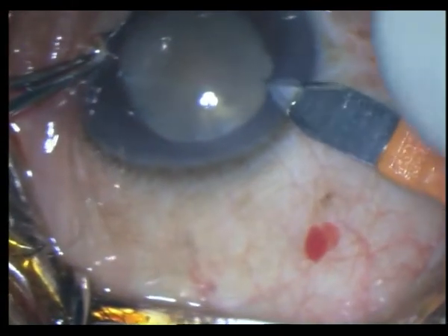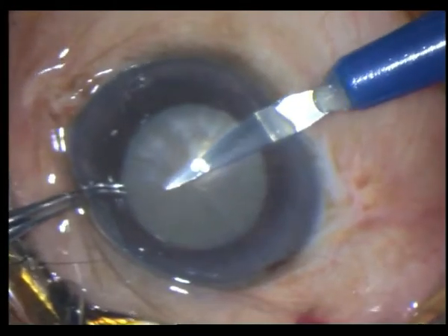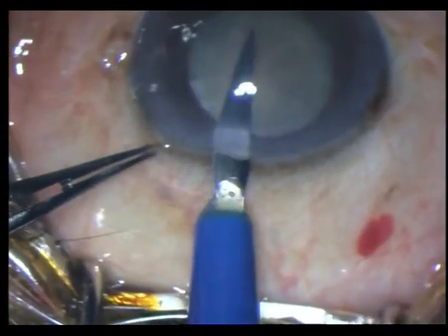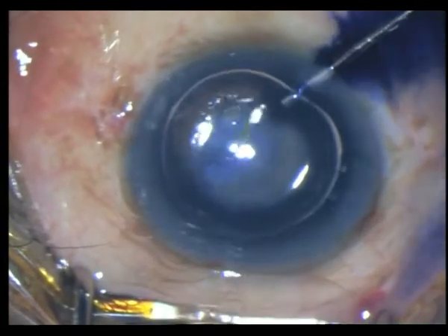After which I place two side port incisions and stain the capsule with trypan blue, which I expel with 2% HPMC.